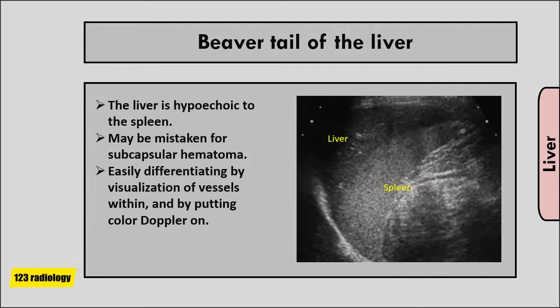In some conditions, the left lobe of the liver can get large and wrap around the spleen — this is called beaver tail. Because the liver is hypoechoic relative to the spleen, it may sometimes be mistaken for a subcapsular hematoma. This can be easily differentiated by visualization of vessels within the liver and by applying color Doppler.